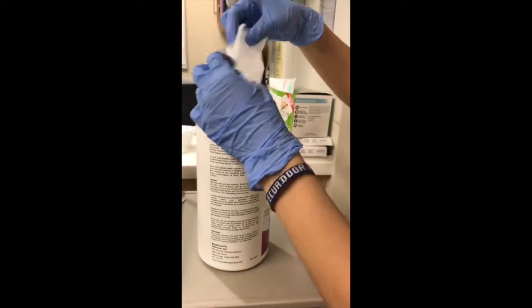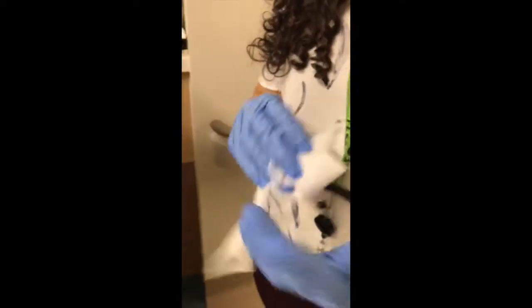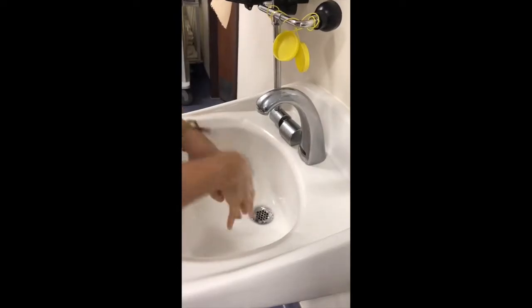Lastly, when cleaning a stethoscope, put on gloves and taking a PCS 5000 wipe, be sure to apply rigorous pressure to both the diaphragm and the bell of the stethoscope. This should be done in between patients to reduce cross-patient contamination. When finished, be sure to dispose of gloves and perform hand hygiene.